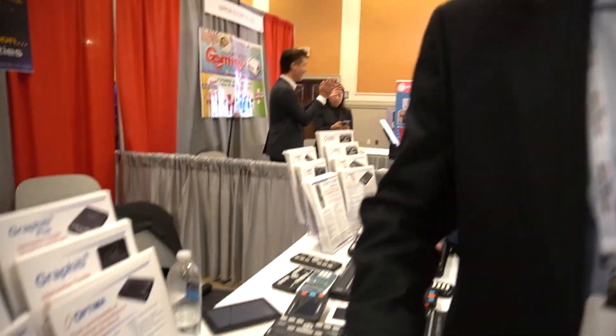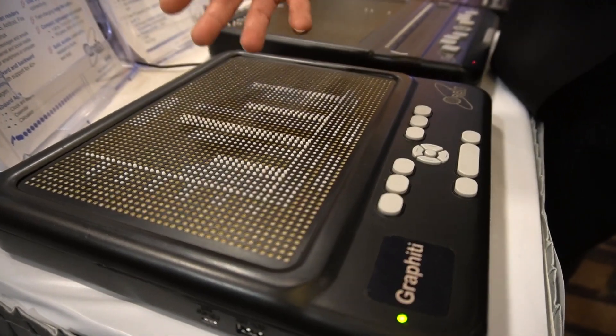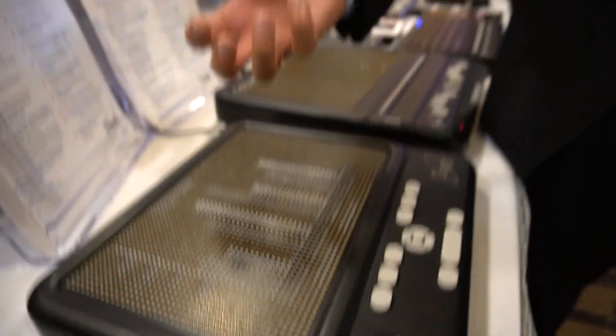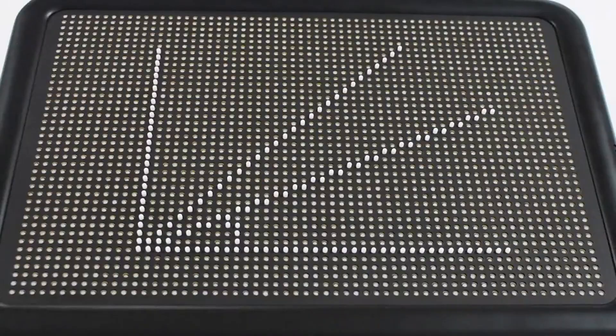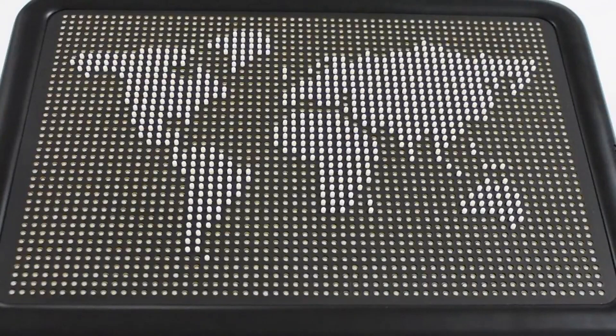Sure. So the Graffiti is a tactile graphic display that has 60 columns and 40 rows of dots. One of the unique things about this display is that each pin can be set to different levels — there are five levels — and this allows you to create not only two-dimensional pictures but also three-dimensional ones. You can use the height to represent things like color, texture, importance, and various attributes.